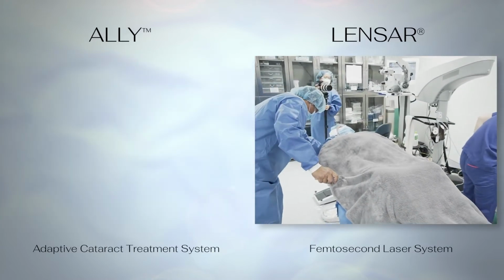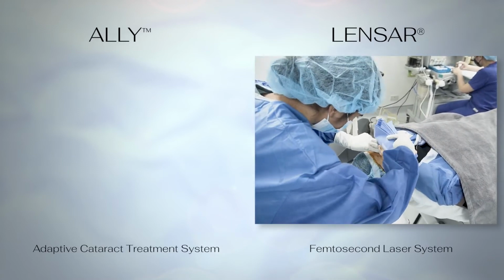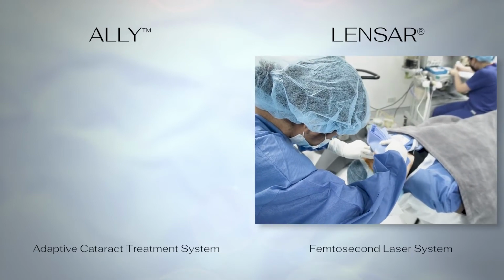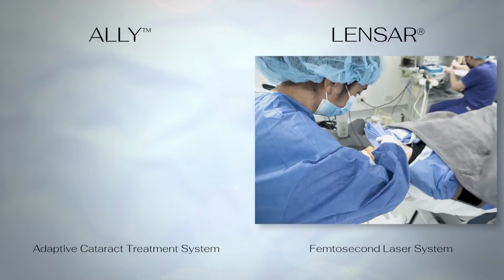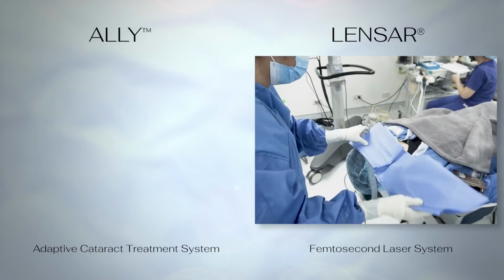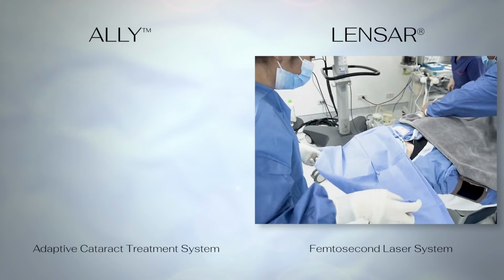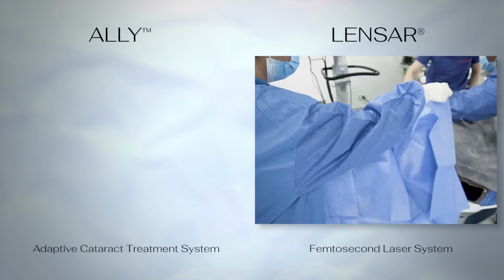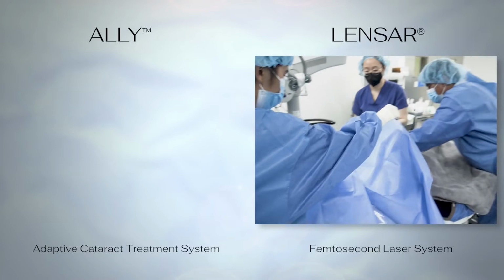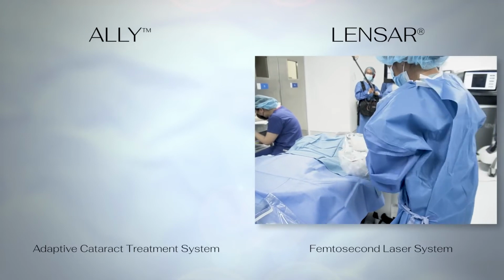Back here with the LENSAR system, we actually take about 6 to 7 minutes to transfer the patient from the LENSAR, the Femto unit, to the area where we're going to do the phacoemulsification. If you do your cases in about 6-7 minutes, that's already the amount of time it takes you to do the phacoemulsification. So using the original laser, by the time you're ready to start the phaco procedure, if you were using the ally unit, you'd probably already be finished doing the whole procedure.